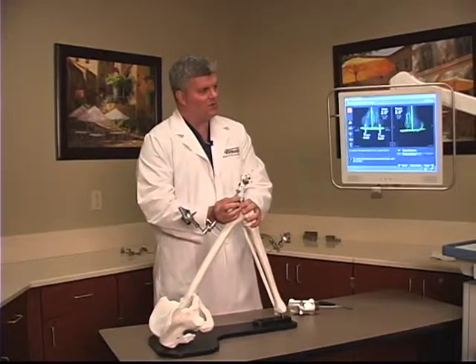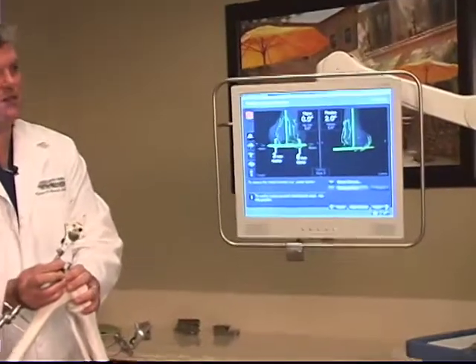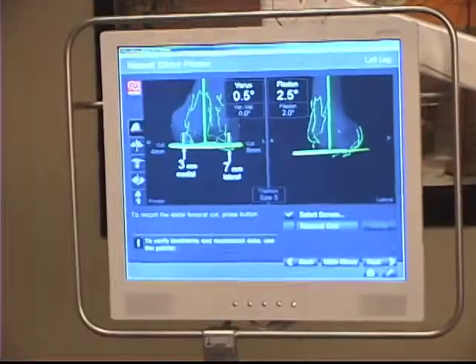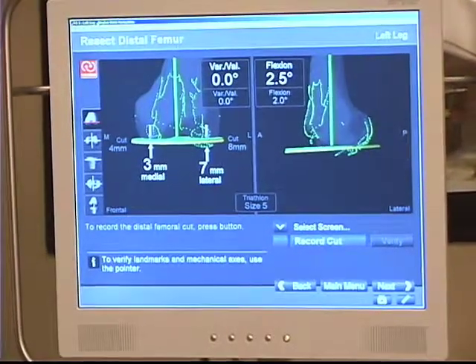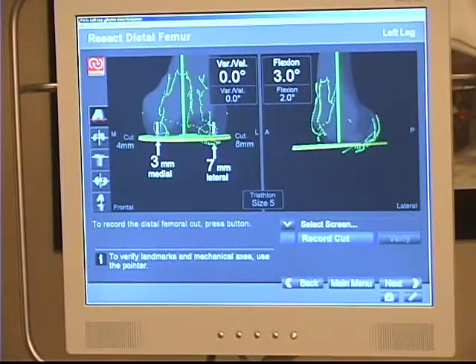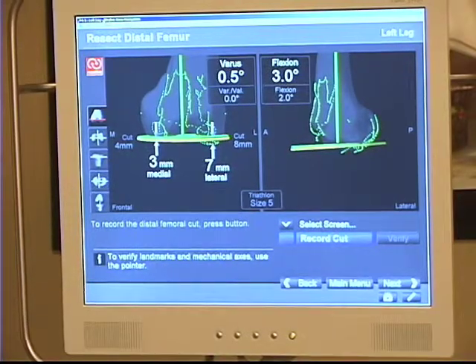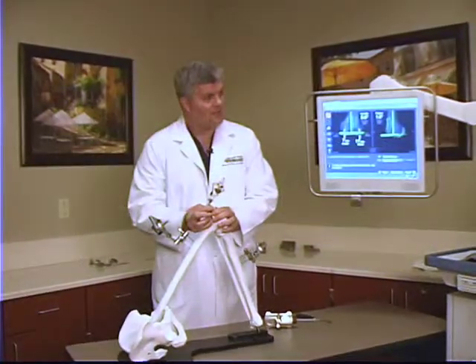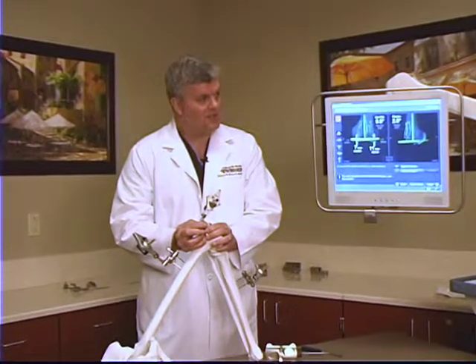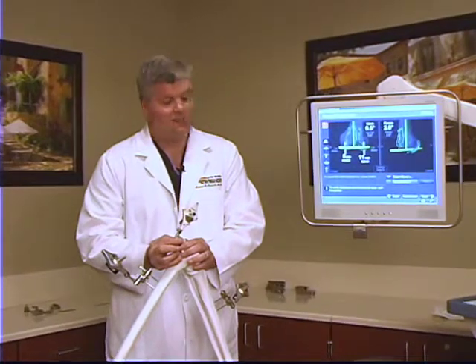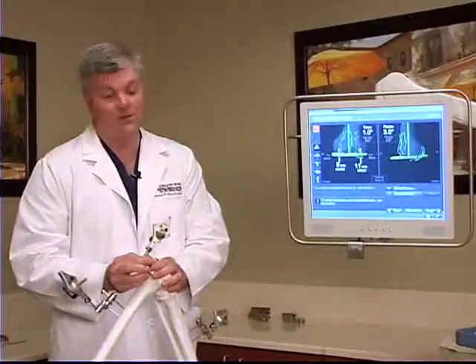The first cut we're looking at is the distal femoral cut. The computer is asking us to place it in two degrees of flexion and zero degrees of varus/valgus, which I'm working on getting down to a half a degree. That is infinitely small movements with my hand to change that cutting block by half a degree — I cannot see that. Once I take the mechanical alignment and place the cutting block exactly where the computer is asking me, the post-operative X-rays are no surprise. They're always the same. I know it's accurate.